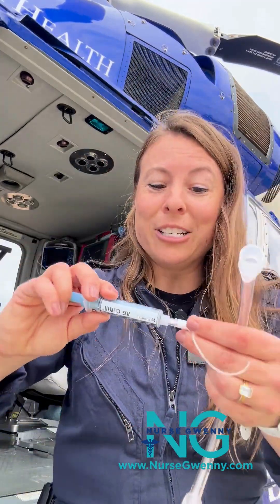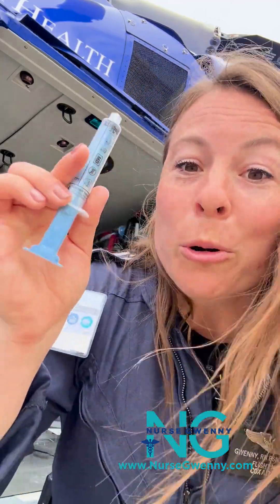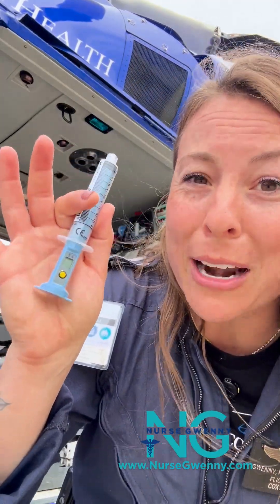But what usually happens when we intubate our patients? We grab a syringe and we slam it full of air, and we tend to overfill it. In the history of my career, I have never checked a tube that wasn't already checked by a manometer and found it to be within a safe range of pressure. It's always overfilled, which is why it's so important that we come in with the manometer and check these pressures.